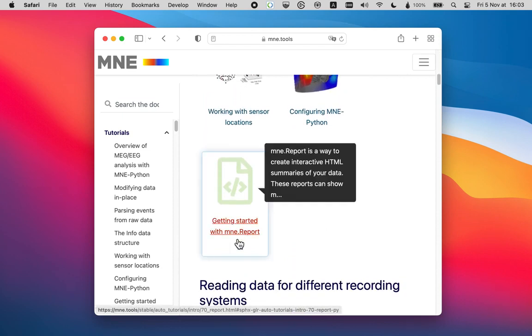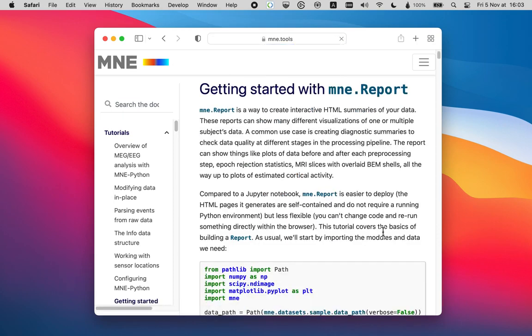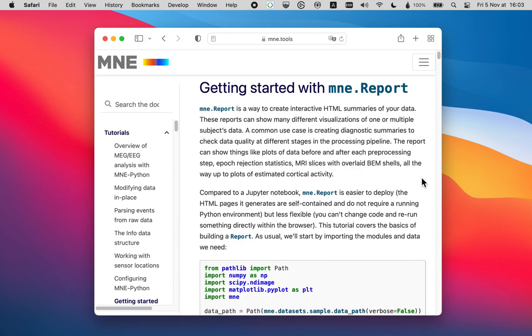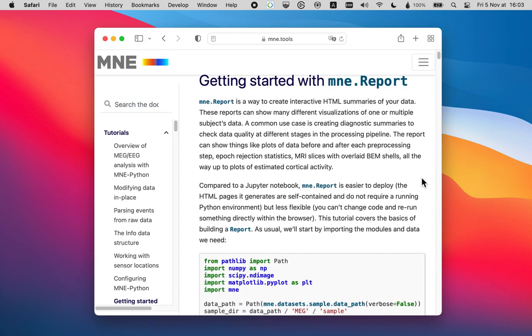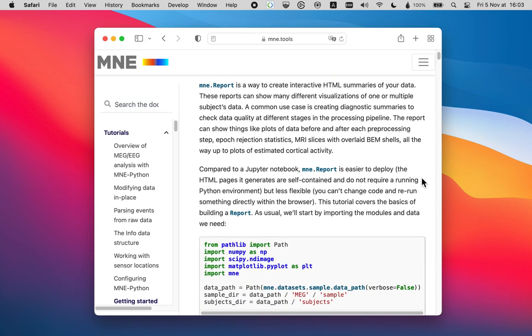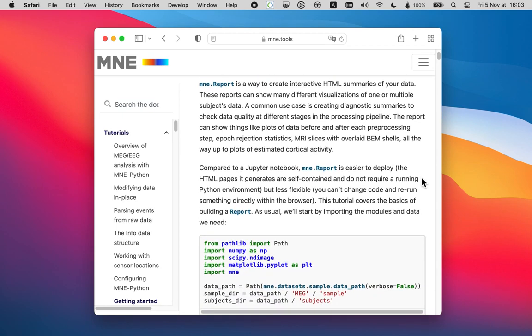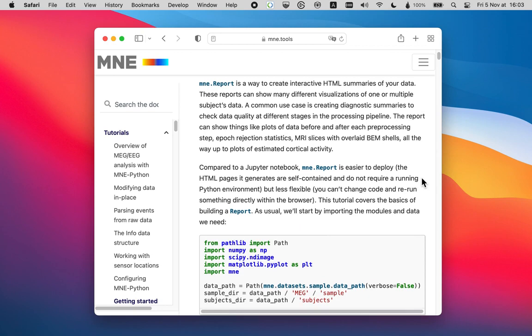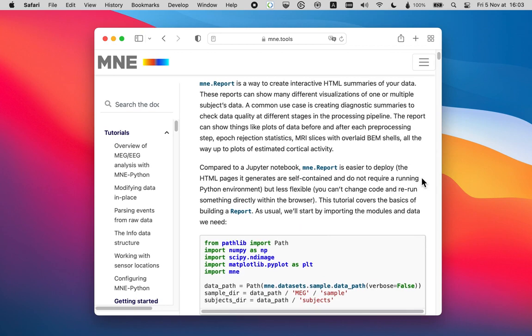Scroll down a little bit. And you will find this tutorial, getting started with mne.report. And you will find an explanation of all the different methods that the report supports and all different ways in which you can utilize it. Thank you.